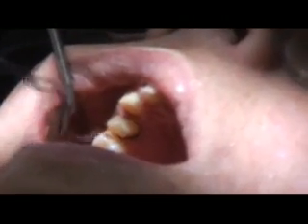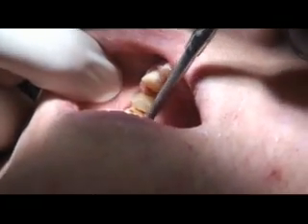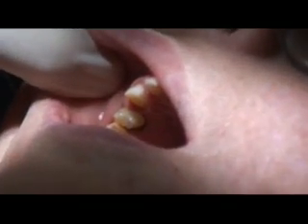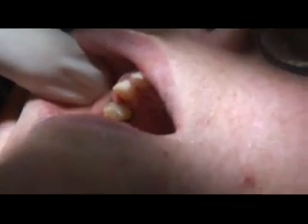Get the large cord out. Look at how we can see the margins so clearly everywhere. There's plenty of good exposed margin, and there's no bleeding. This is a perfect setup for a nice impression. Okay, great.